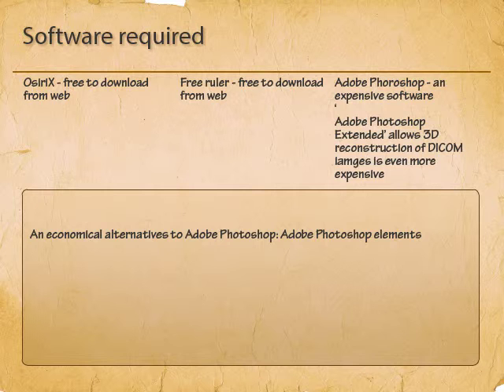Another flavor of Photoshop is called Photoshop Extended. It is very powerful. It allows importing of DICOM images and reconstruction of 3D images. However, it's very, very expensive. A more economical version of Photoshop is Photoshop Elements. I have not tried Photoshop Elements myself for this tutorial, but I am pretty sure that you should be able to use Photoshop Elements to complete the steps. But please check with the trial version.